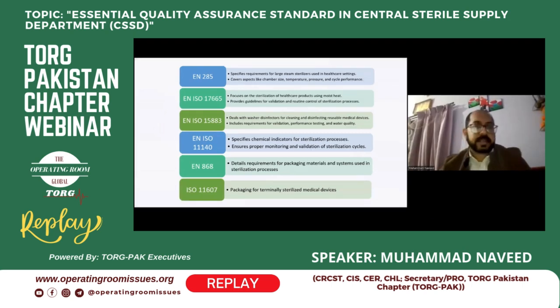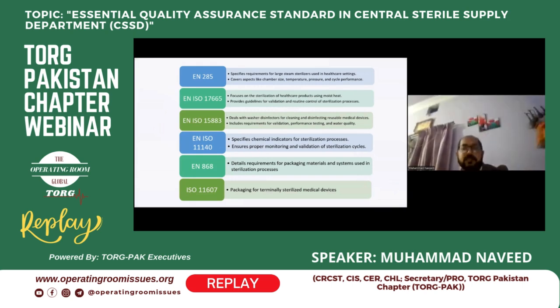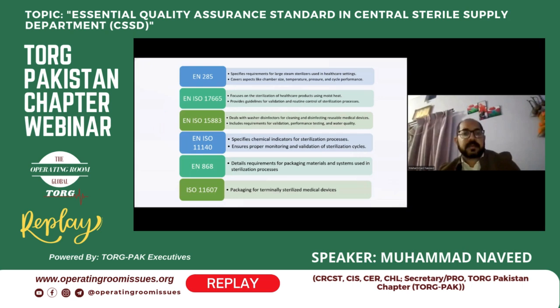We were at EN 868. We're talking about the packing materials and the sterilization process. So EN 868 tells us what type of packaging material we are using for the reprocessing of medical devices. The next one is ISO 11607. That standard tells us about our packing for terminally sterilized medical devices. After the sterilization, how can we maintain the integrity of the sterilization? This standard tells us about these things.